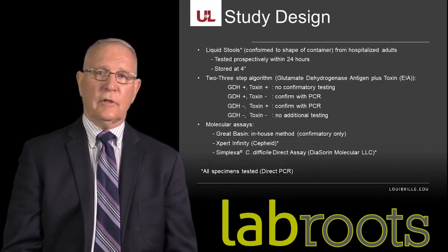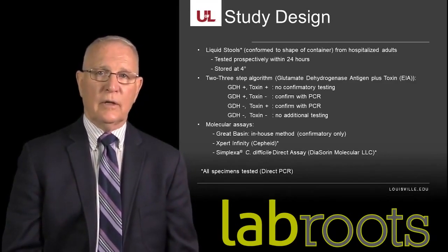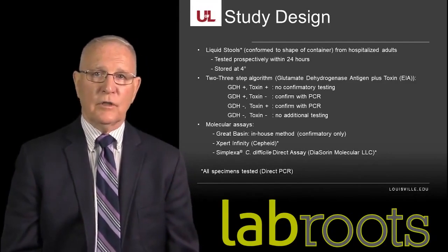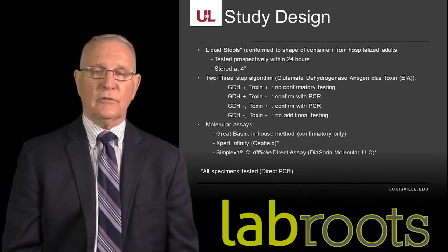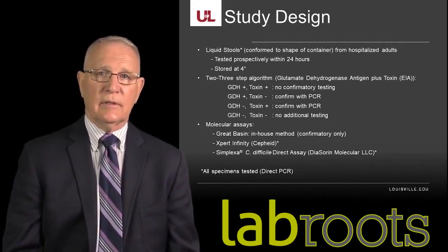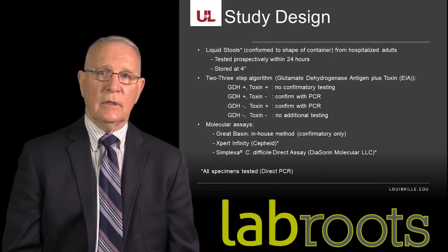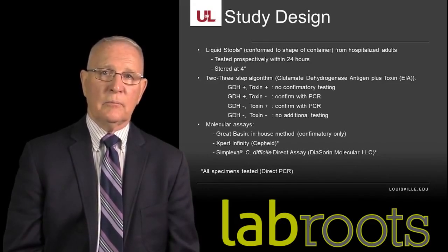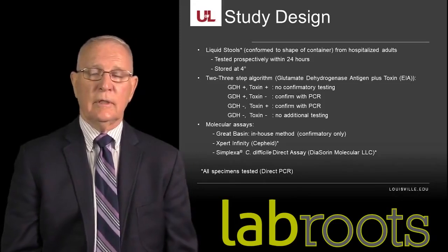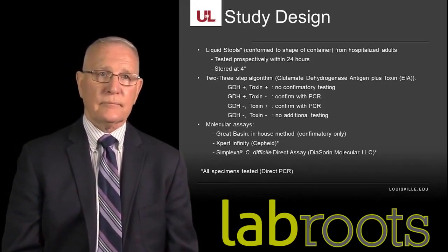With regards to our study design, and I remind you this was an evaluation, this was not an in-depth, high-volume sample study. It was designed to ask the question, can the Diasorin PCR instrument or technology perform at a level comparable to other PCRs and be integrated successfully into an algorithmic testing format?